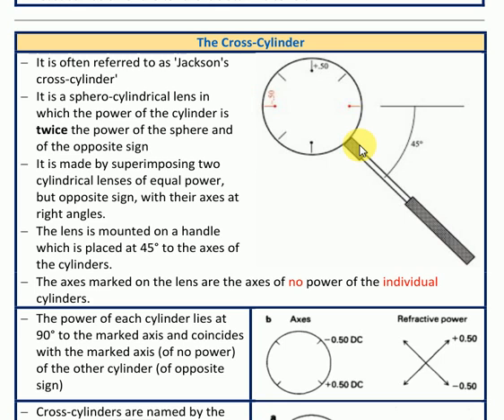The cross cylinder is held in the preferred position in which the patient has better visual result, and the axis of the trial cylinder is rotated slightly towards the axis of the same sign on the cross cylinder. This process is repeated until the trial cylinder is in the correct axis for the eye, at which time rotation of the cross cylinder will offer equally unacceptable visual alteration to the patient.